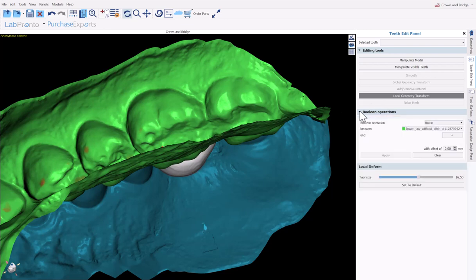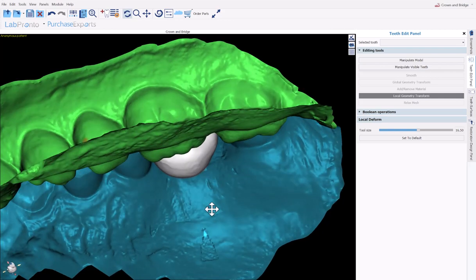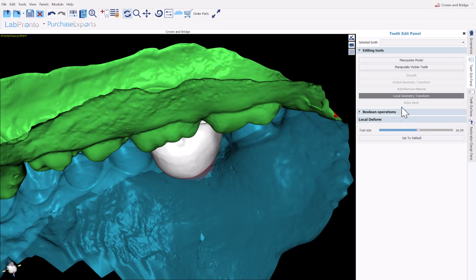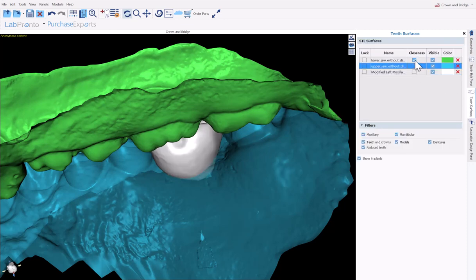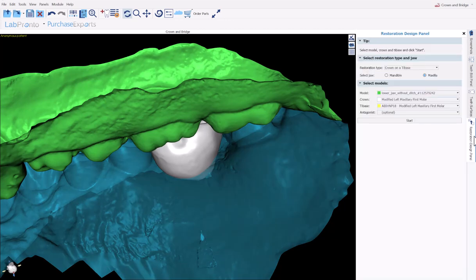We also have here different boolean operations, which we're not going to get into in this video, but you should know that they exist. So at this point, if I am happy with my tooth design, we are going to turn the teeth into our crown. And we'll do that via the restoration design panel.